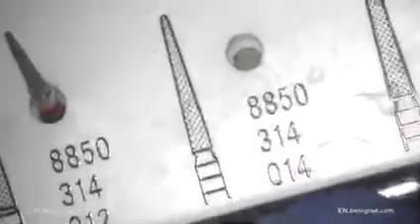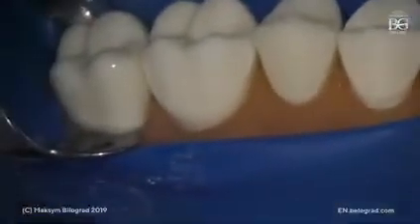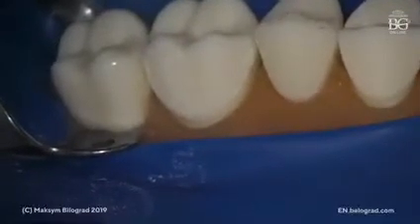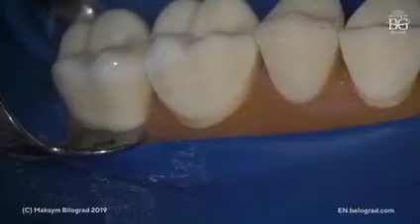You can see this number, this red diamond. The tip of this burr is 0.6 millimeters. The tip is rounded, so we have to use half or less than half of the tip. If you use half of the tip of this burr, you'll have a 0.3 finish line, which is good for many dental technicians and for many ceramic restorations.